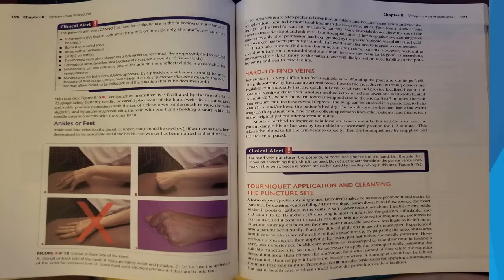Another method to improve vein location, if one cannot be felt initially, is to have the patient dangle his or her arm by their side in a downward position for 1 to 2 minutes. This allows the blood to fill the arm veins to capacity. Then a tourniquet may be reapplied and the area repalpated.